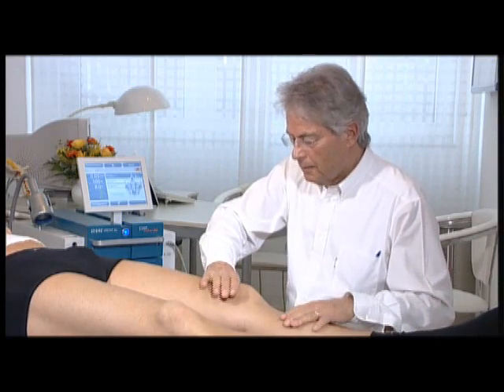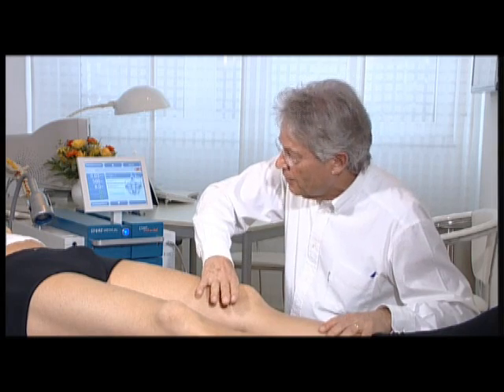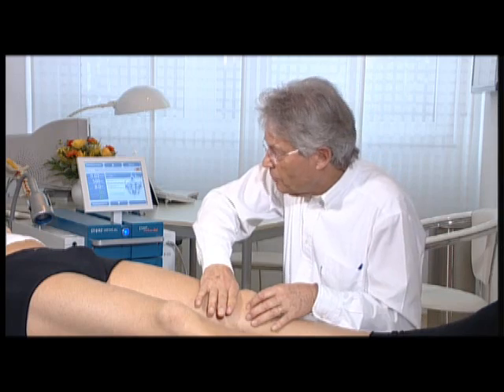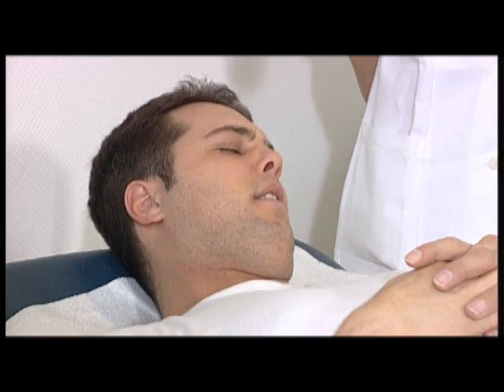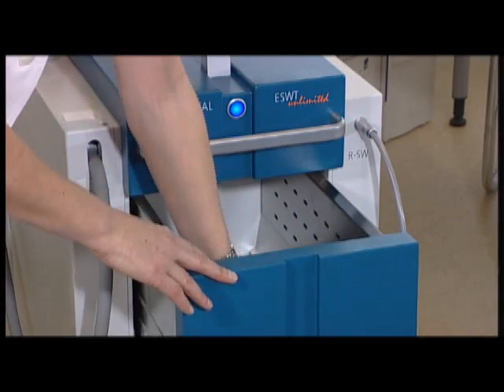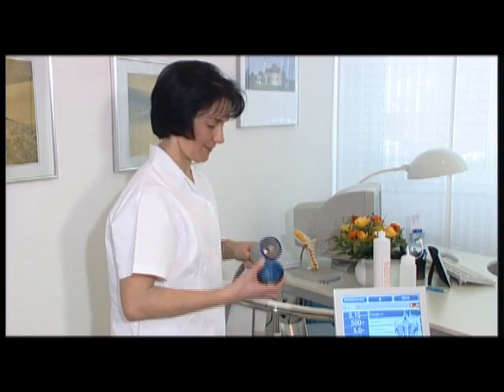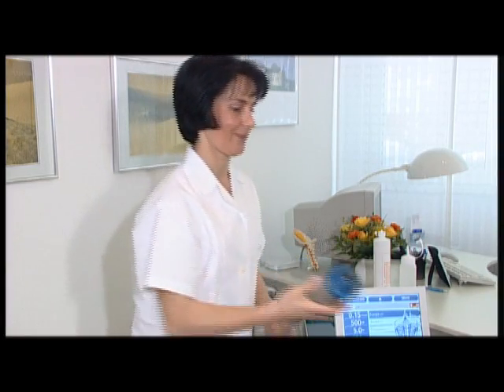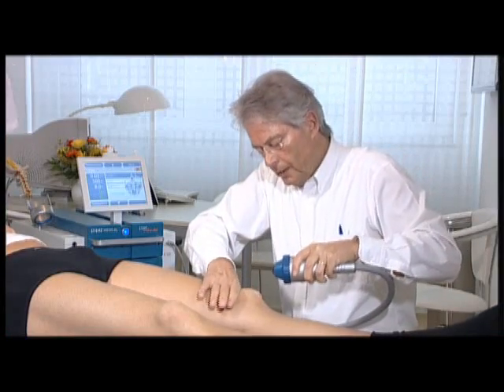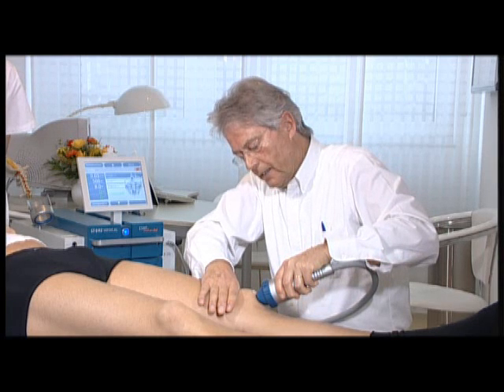Patellar tendonitis is a frequent form of insertional tendonitis, especially among amateur sports people. The painful spots are localized by flat palpation and by pressing the patella upwards. Owing to its unparalleled versatility, the Duolith SD1 also opens up new possibilities for diagnostic applications. Precise localization of the painful spots is ensured by using focused shock waves. Ich bleibe hier oben mit der Hand liegen und setze jetzt bei 6 Uhr an.